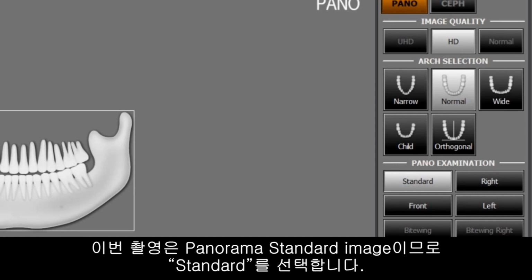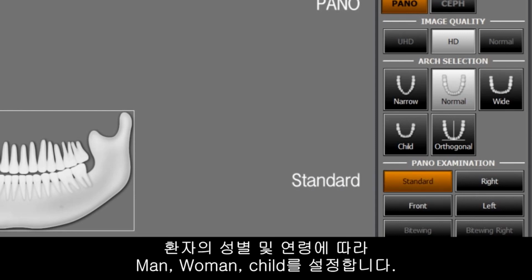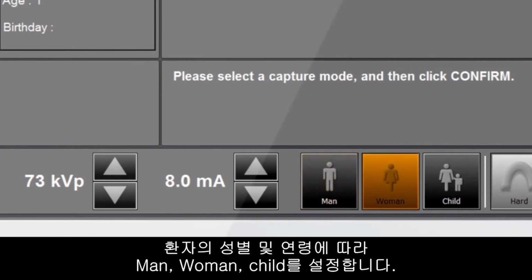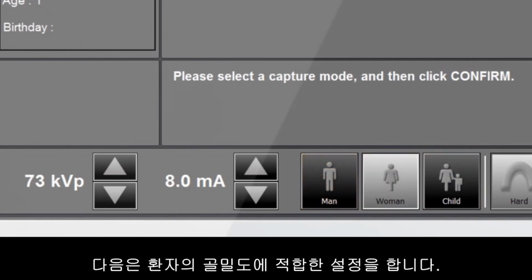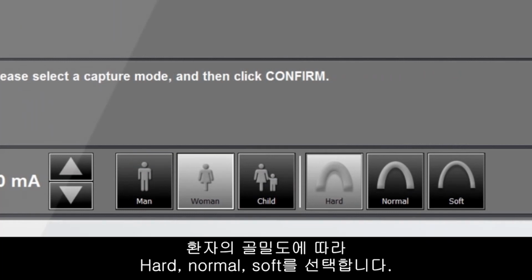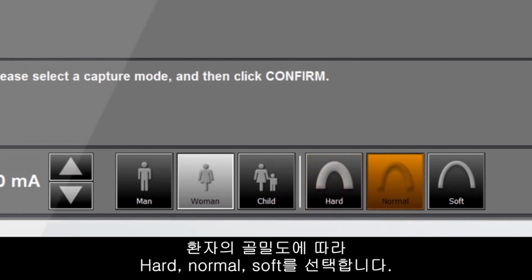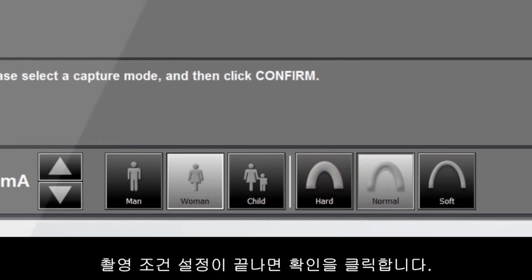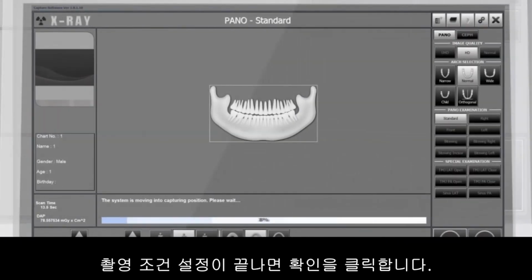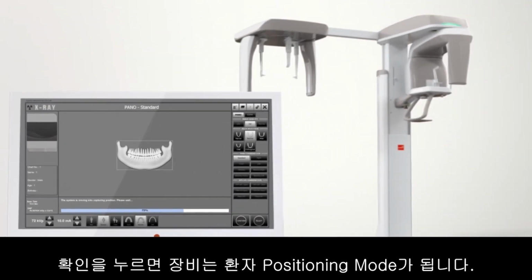Now, for the Panorama Standard Image Capture, please select the Standard. According to patient's gender and age, select man, woman, or child. Next, please select the appropriate setting for the patient's bone density type. Depending on the patient's bone density type, you can select hard, normal, or soft. Click the Confirm button when the patient setting is completed. Then the equipment will set in positioning mode.